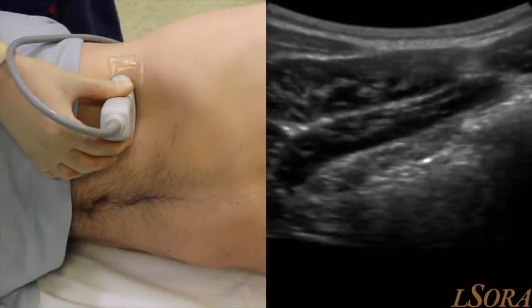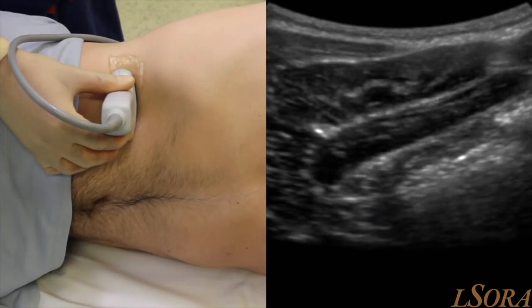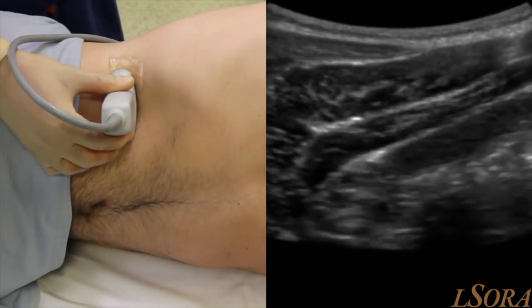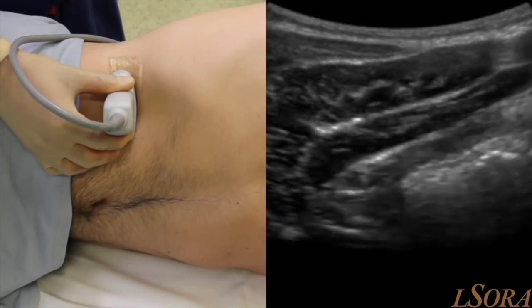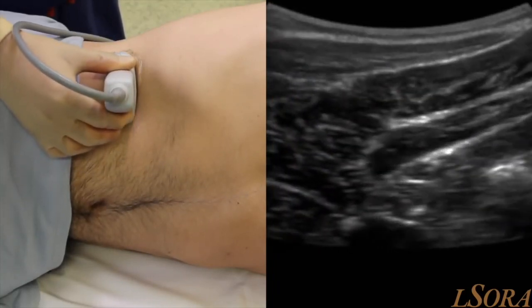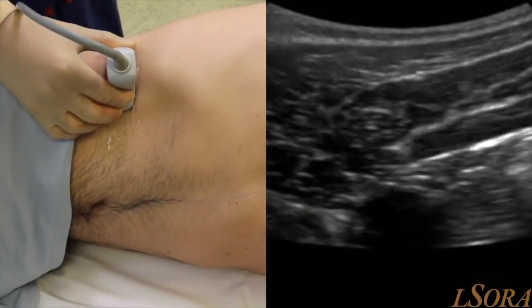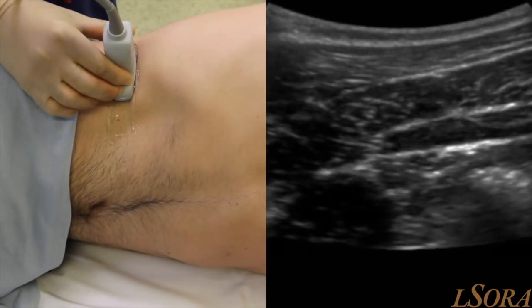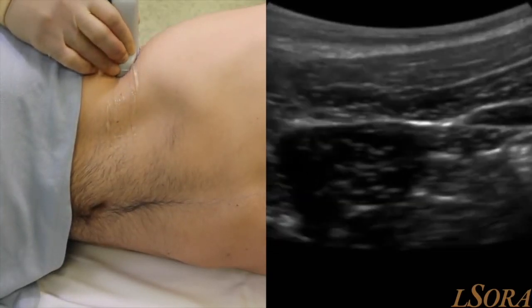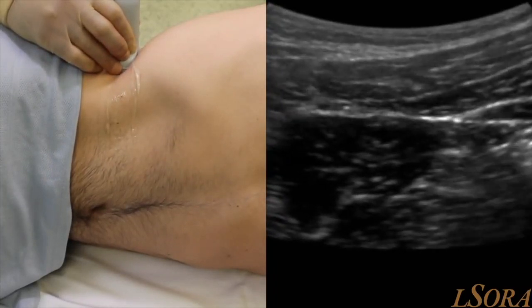As we continue to slide laterally, we'll appreciate the liver coming into view with the patient's respiration. You can see the liver edge coming down. And then we can continue to move laterally over towards the lateral part of the abdominal wall. Once we have reached the space between the iliac crest and the costal margin, the depth of view is increased.